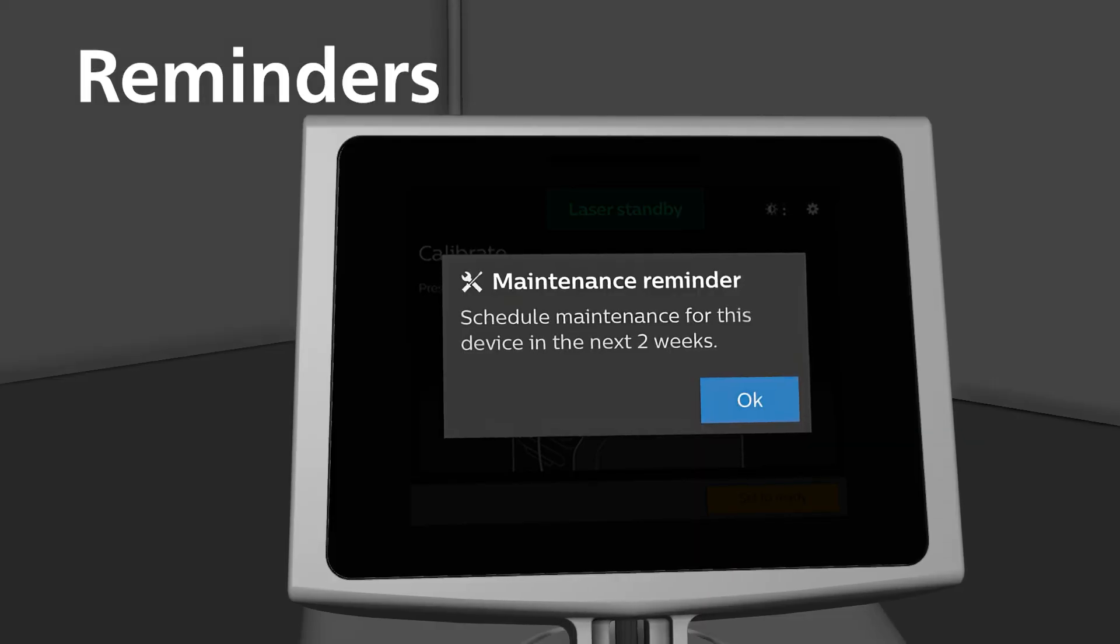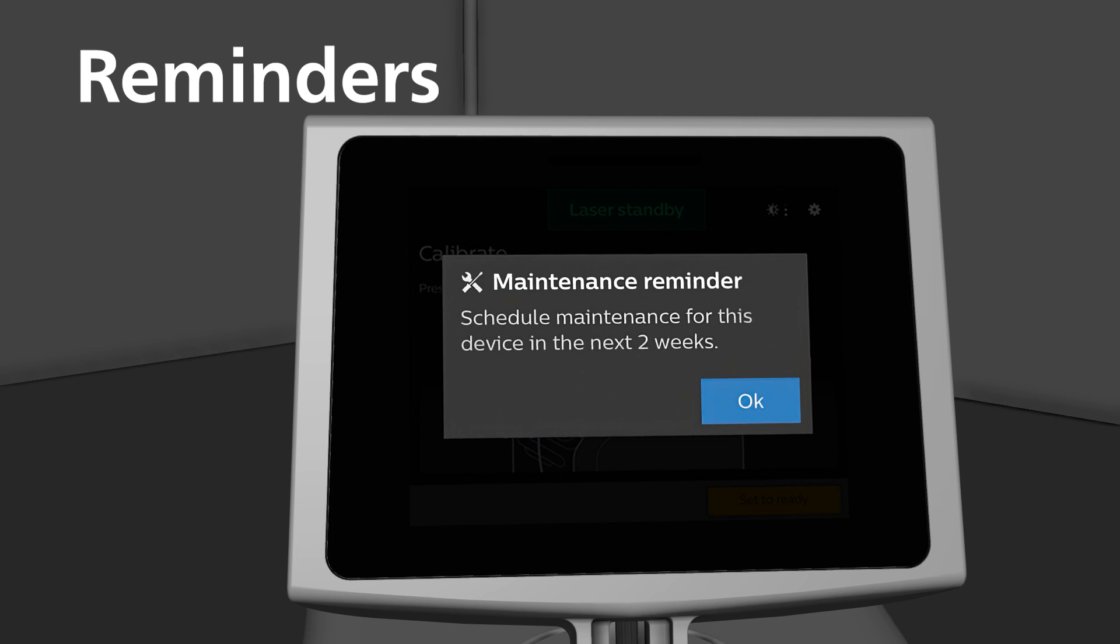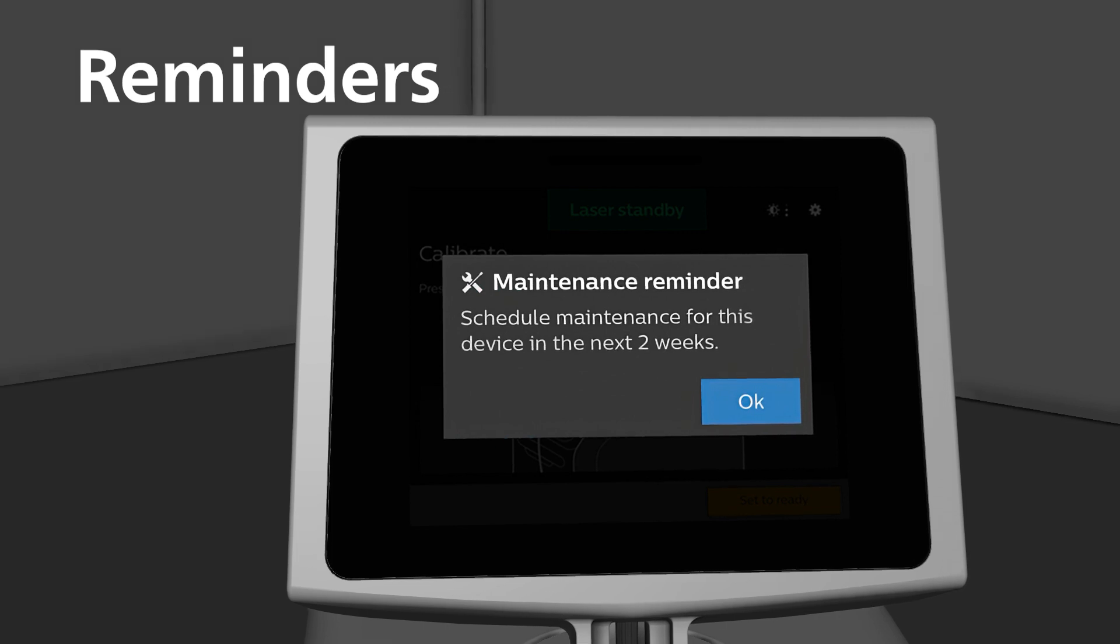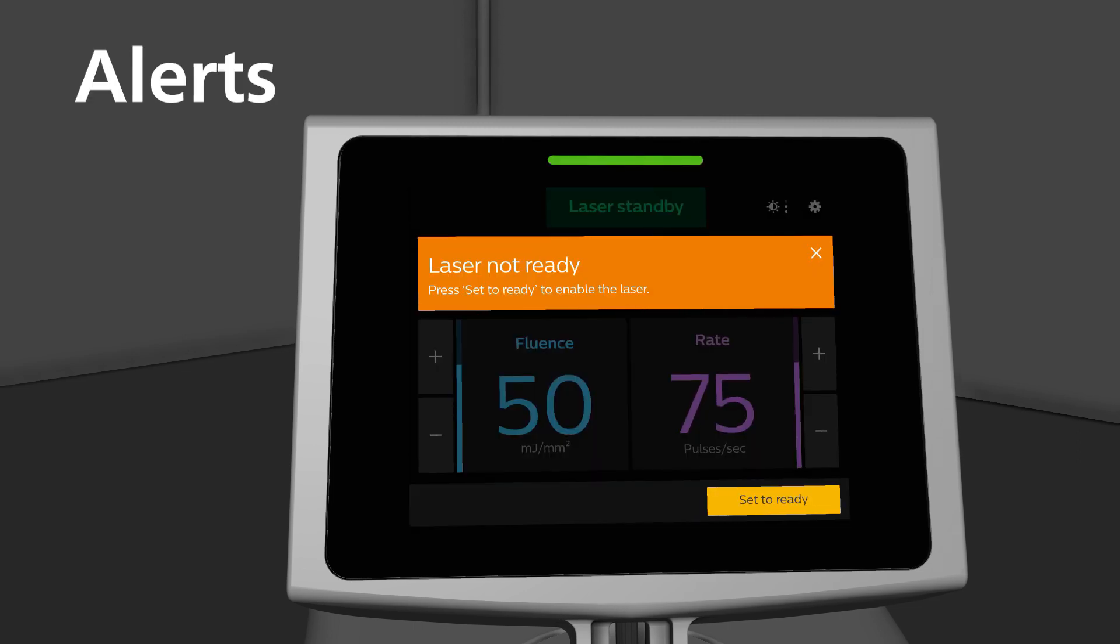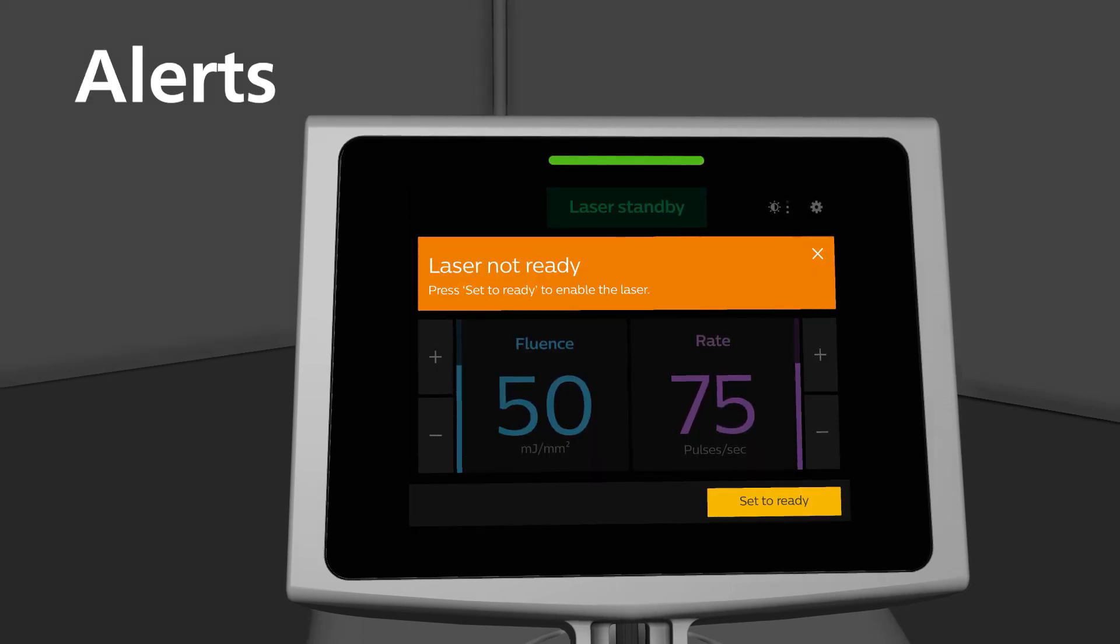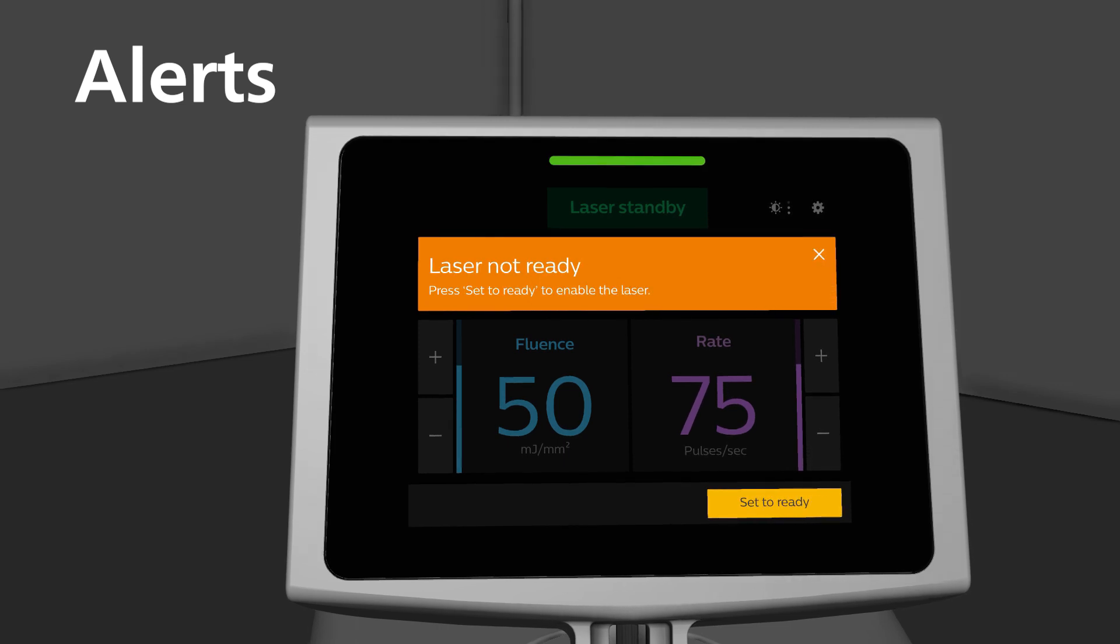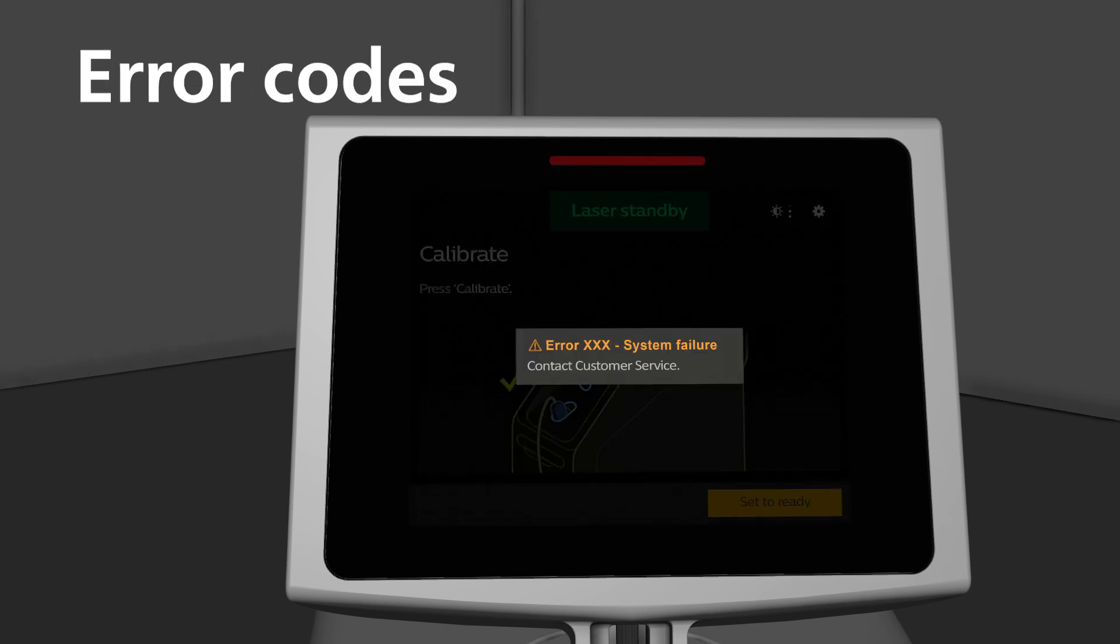The laser system has helpful reminders, alerts, and error codes that provide actionable solutions. To ensure your system stays up to date, there are routine system maintenance reminders that will appear when maintenance is needed. Alerts provide guidance to the user during workflow if an action is needed. When prompted by an alert, follow the instructions that are displayed.